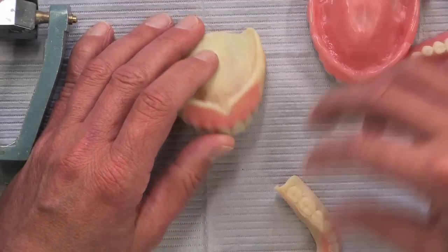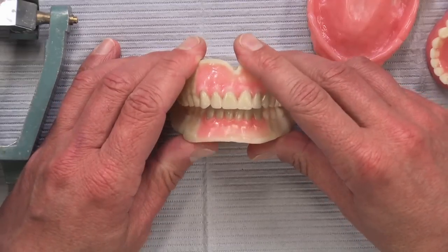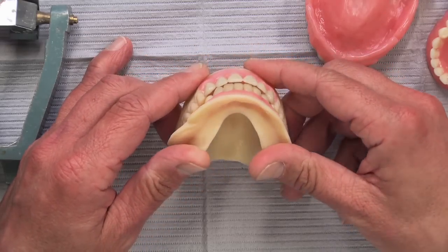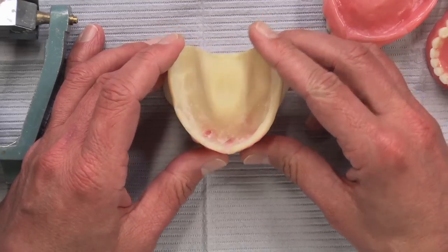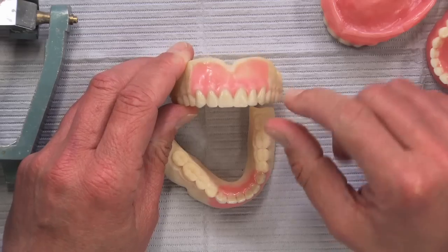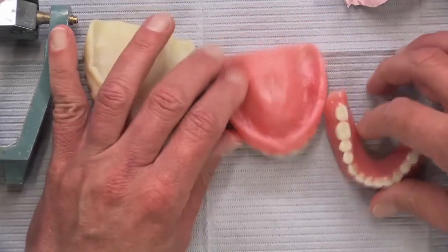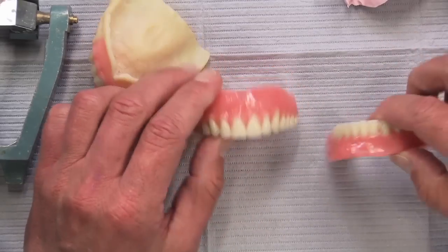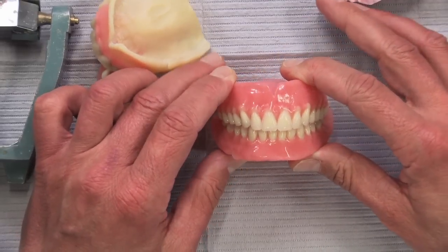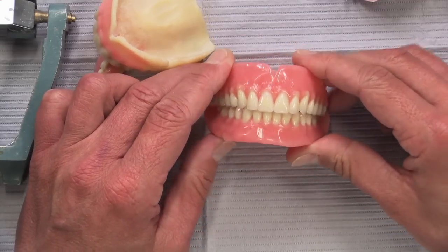The bottom line is we've seen CAD-CAM really change our laboratory in fixed prosthodontics, and now for the first time we're seeing it used in removable prosthodontics — in this case for a full upper and lower denture. The advantage is being able to see how the denture is going to fit at that first appointment, and the ability to move up to 12 teeth if needed. If the patient and doctor are happy, the next appointment you have a set of finished dentures. The fee is the same as our regular dentures — no additional charge for CAD-CAM dentures or for keeping the digital files on file.